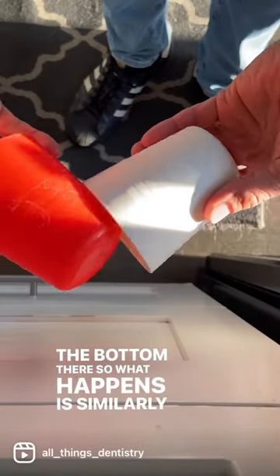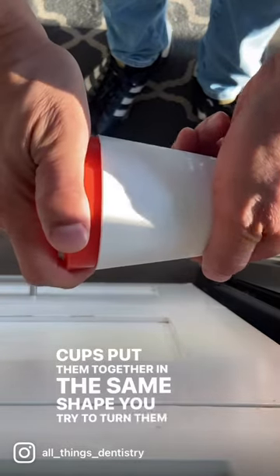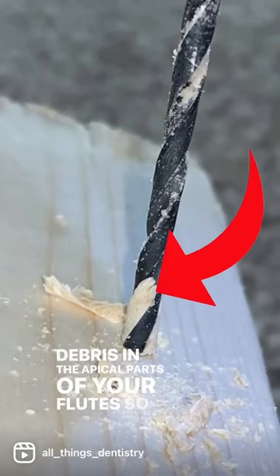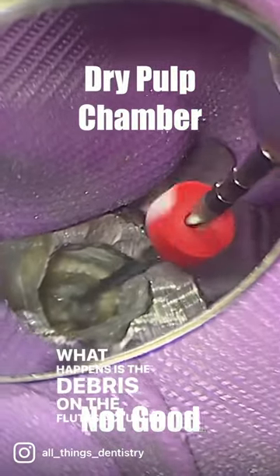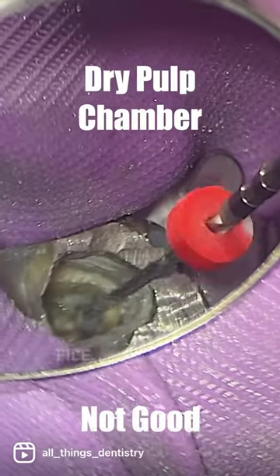Similarly, if you take two cups, put them together in the same shape and try to turn them, the friction tends to keep them from turning. That's the debris in the apical parts of your flutes. It's important when you're doing root canals to keep your flutes clean. The debris on the flutes actually acts to increase friction and potentially will act to fracture the file.